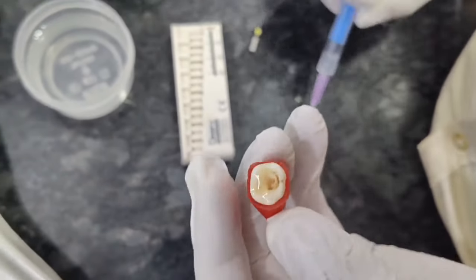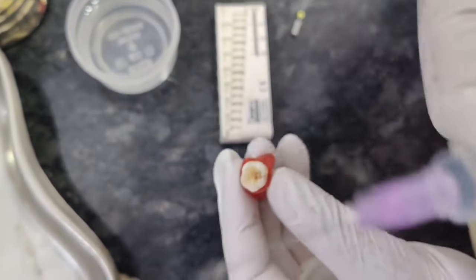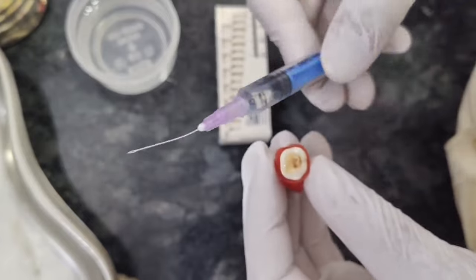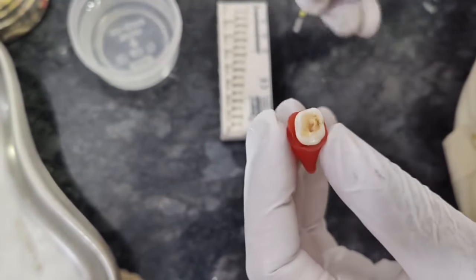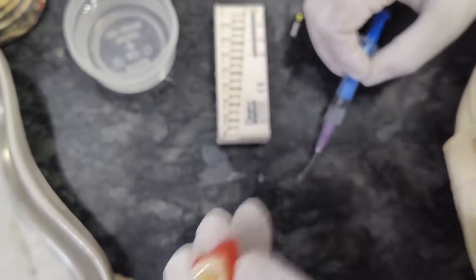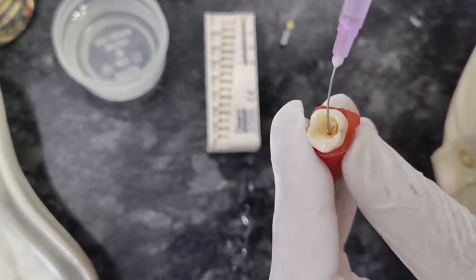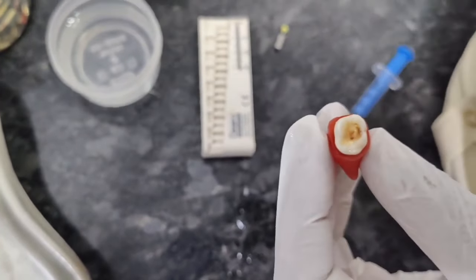Now you will ask me how much irrigant we should use. For one canal, you should at least use 40 ml, which means 20 times for one canal. It's not humanly possible to do so much. So at least 5 to 6 times for every canal, you should clean with hypochlorite solution after every filing. Okay.